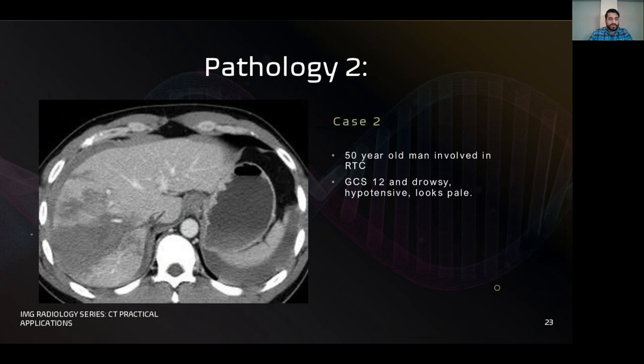Again, what do we think might be going on? So this particular region here and here and here, how would you compare it to this region here? Do we think it's different? And what is the term that we would use to describe these tissues? So again, this is more hypoattenuated or hypodense compared to the surrounding tissues. Hypodense, yep, good. So this is actually blood and essentially a little bit of edema as well, but the patient's had a liver laceration, that's what's happened, and they are essentially bleeding. So there's a bit of edema and swelling and some blood there as well.